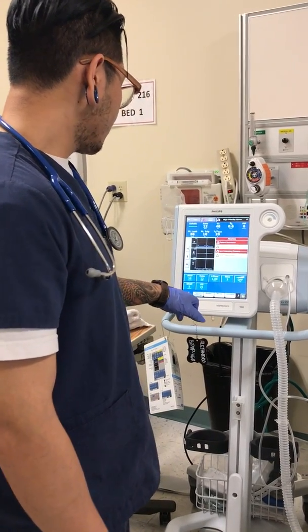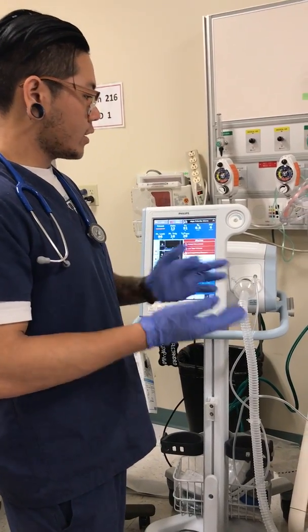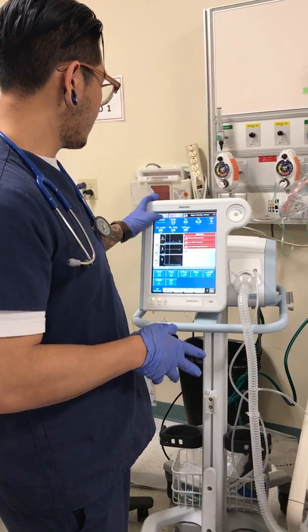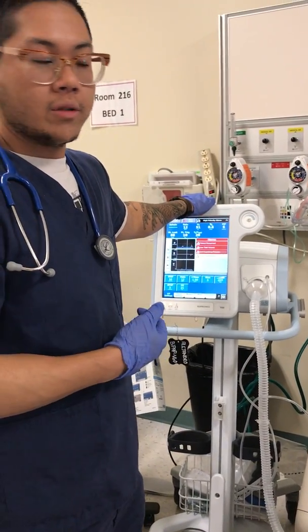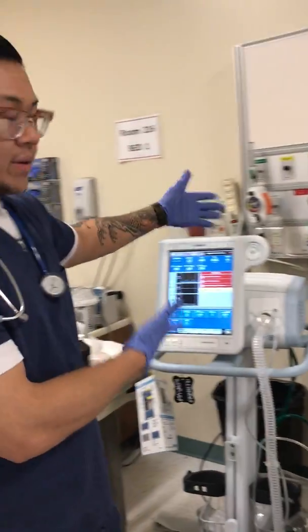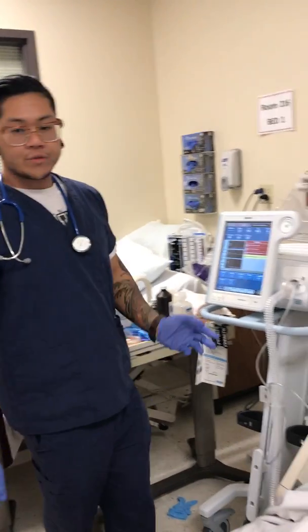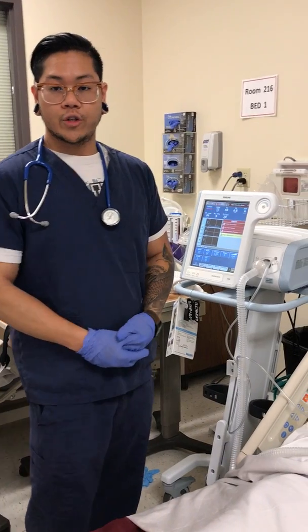Okay. So if you're with the patient and they look like they're doing okay, you just want to monitor them and see that everything is going all right. If you need to take an ABG from the patient, make sure you do it 30 minutes after you put them on the machine. The reason for that is because you want to check their pH levels, their oxygen, and their carbon dioxide.